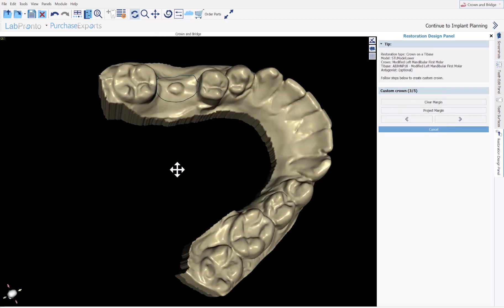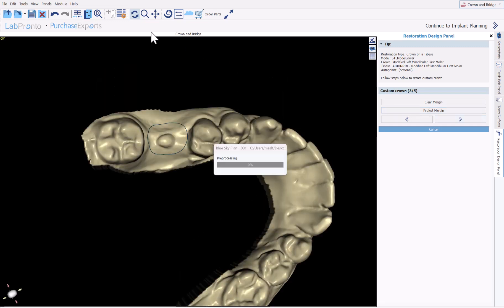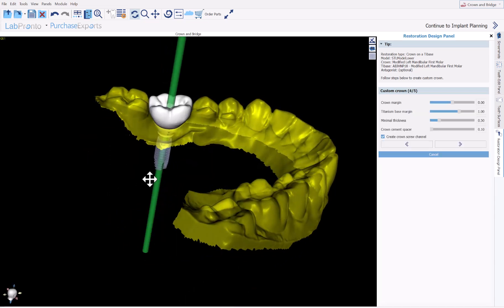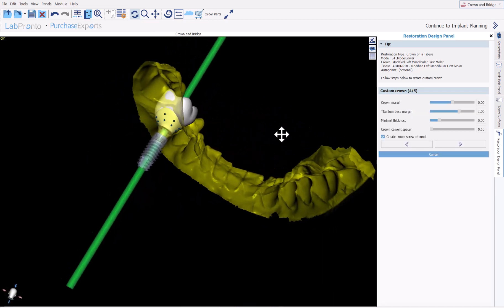Here we have a margin on our model. To take the margin from the tooth that was designed and generated, click Project Margin, and then click Next. Here we have our tooth that has pretty much been turned into a crown at this point.